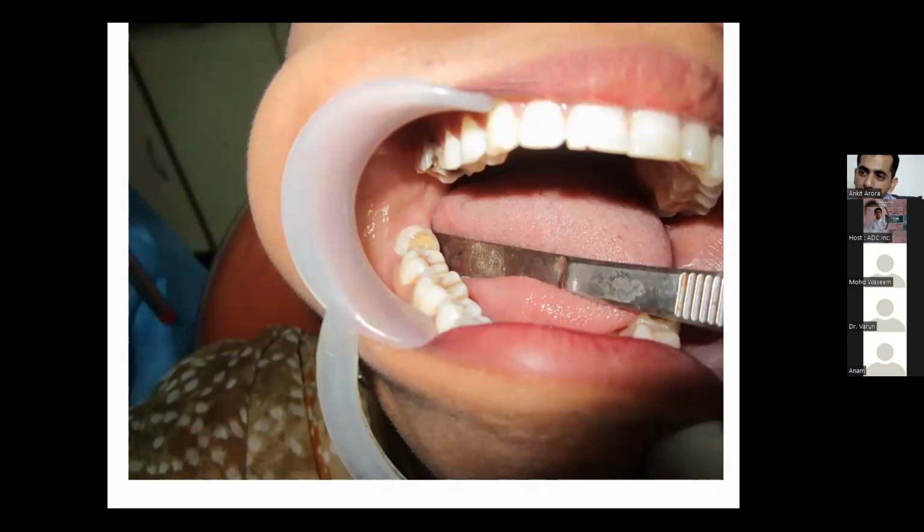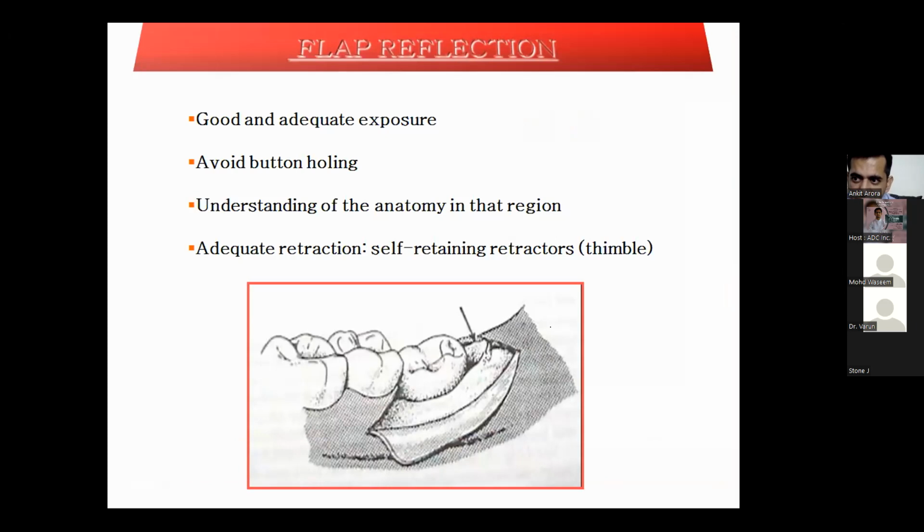Now coming to the clinical presentation, you can tell the patient to undergo an IOPA, which is the more suitable, more practical way of diagnosing the impacted tooth. But if you cannot ascertain the inferior alveolar nerve or the root apices of the impacted tooth, it is always advisable to go for an advanced investigation, be it an orthopantomogram or a CBCT scan. If you can see it in the IOPA, nothing like it. No one wants to send their patient for a higher investigation, but if having one more investigation will help prevent a complication, we should always go for it.